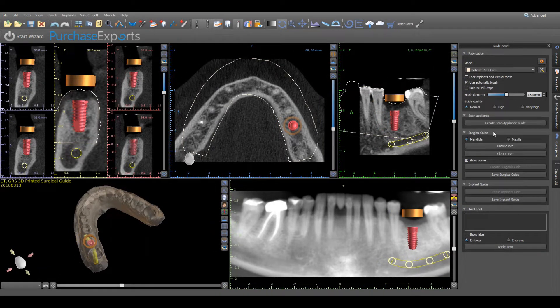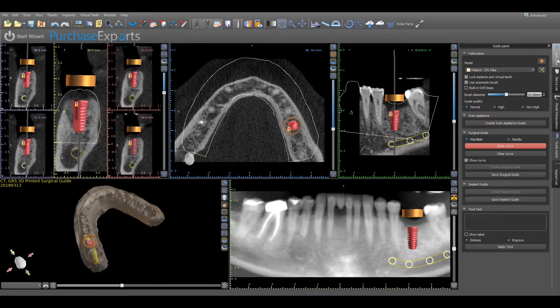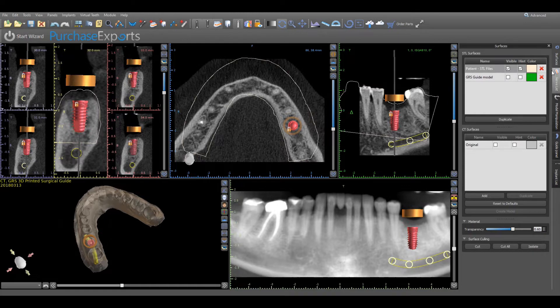Now to design the surgical guide, confirm either mandible or maxilla and then click on Draw Curve, which will automatically lock all implants and teeth in the planned position. Prior to designing the surgical guide, make sure that the virtual model is completely opaque and all transparency has been removed by clicking on the Surfaces tab, highlighting the model to be used, and removing all transparency under the material subheading by using the slider bar to the right.